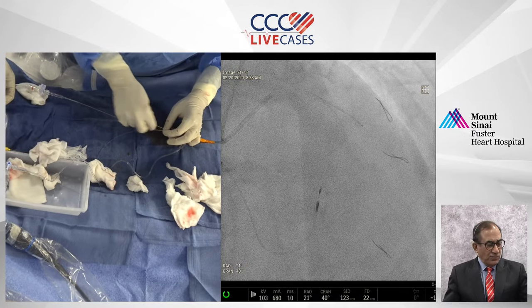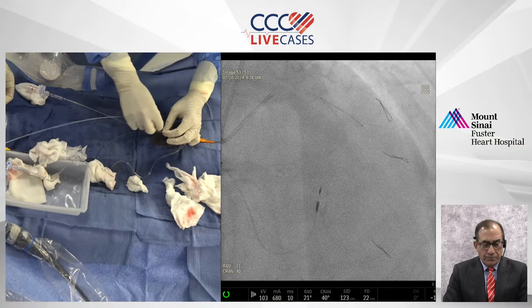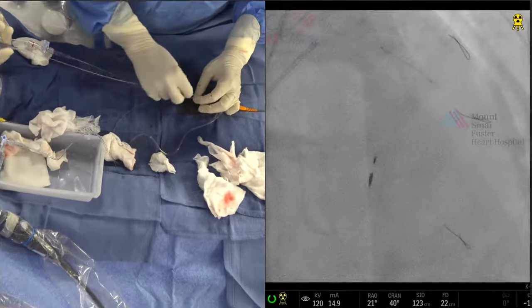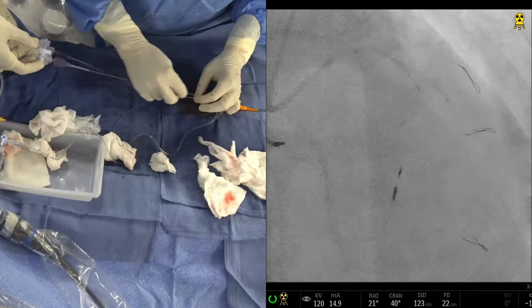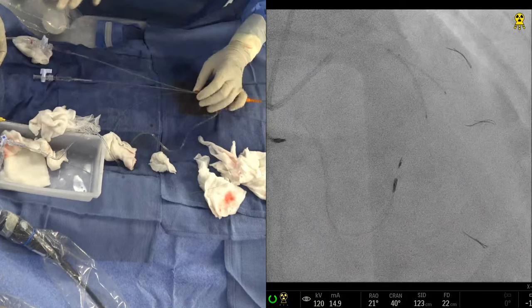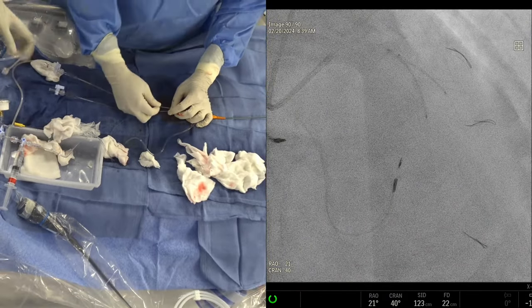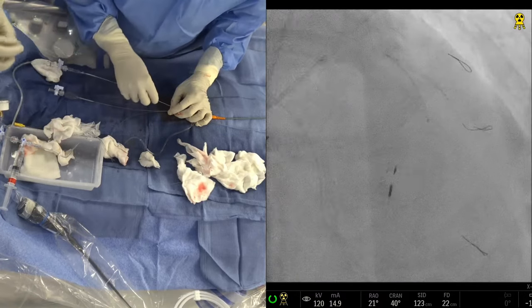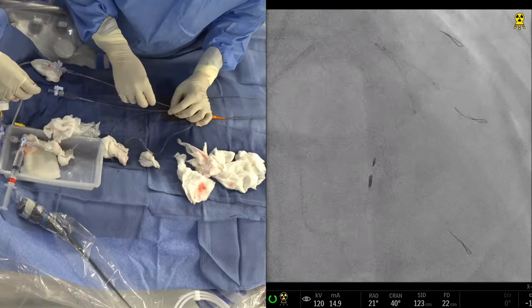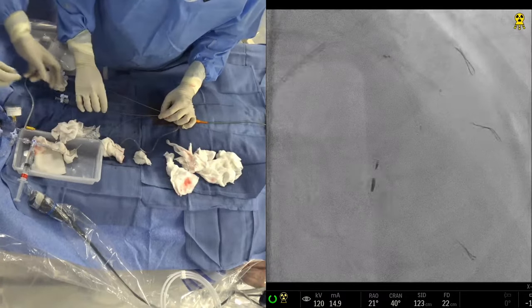No, the question is, why did you not use a cutting balloon for D1? Then you have to open another 2.75 cutter, yeah. So I think ideally you are right. You have to pull back more, way more. Can we place this stent? No. But sometimes your stent will not be able to pull back if it's crushed a little bit. Remember, the stent may be pressed against the wall. What I'm saying is, pull back the LAD stent. We are too far in.